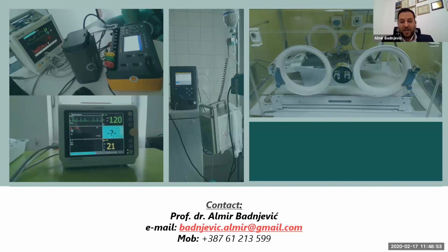But when you are checking by routine maintenance, then you are checking, again, using the sensors and the information of the sensors through the software: are your sensors reading correct values from your devices? And there are many examples where it showed that it is not reading very well. I hope that I answered this question.